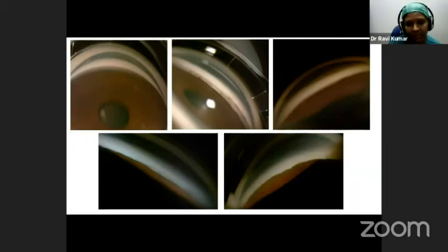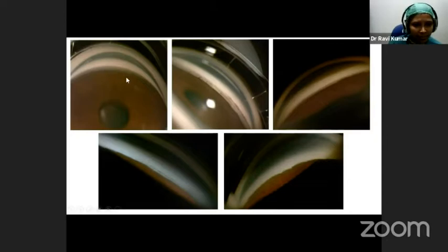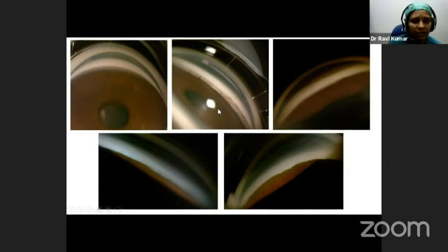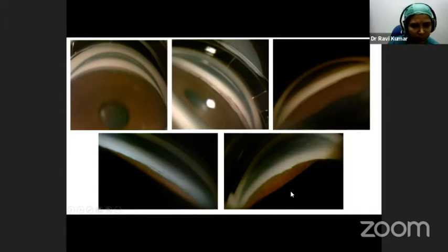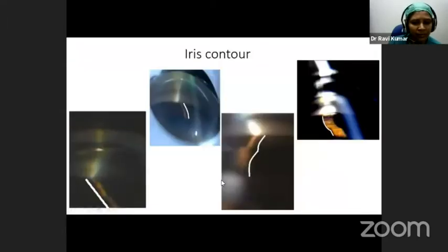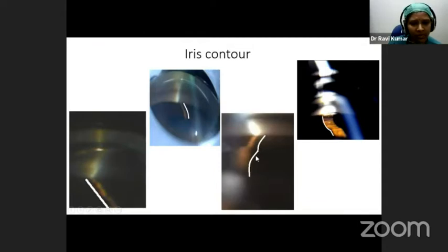We usually grade the angle by the posterior-most structure we see. The ciliary body band, scleral spur, and posterior trabecular meshwork all indicate an open angle. A Sampaolesi line at Schwalbe's line, or no visible angle structures, indicates the angle is not open. We also pay attention to iris contour: it can be flat, convex, showing a plateau iris configuration with a double wave sign, or concave.